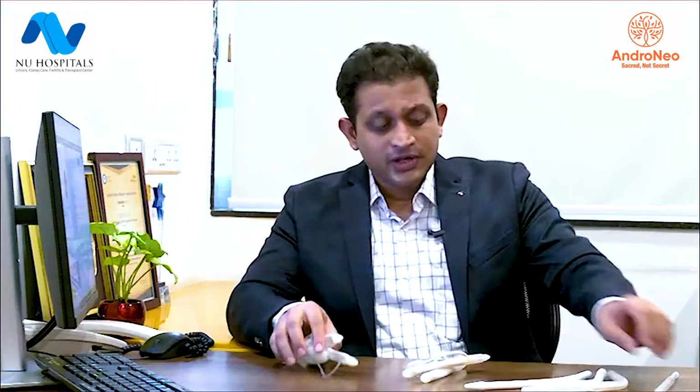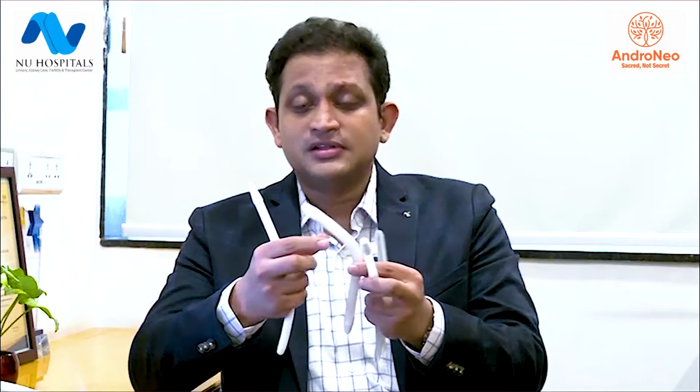The next most common question most of my patients ask me is how long these implants last. For the inflatable implant, the survival rate at 10 years is around 80 to 90%. Whereas when you compare this with the semi-rigid implant, since there is no hydraulic mechanism involved, these semi-rigid implants usually last longer. But comfort-wise, definitely the inflatable implants are better because you get an erection only when you want it. Whereas in a semi-rigid implant, the penis is erect all the time, but one can easily conceal it by bending the central cord. The length and the girth of the penis will not change after a semi-rigid implant is placed.